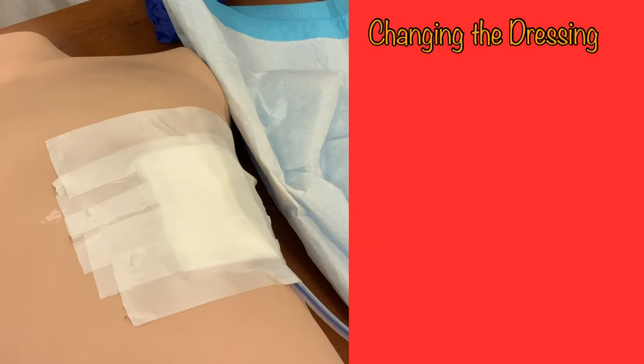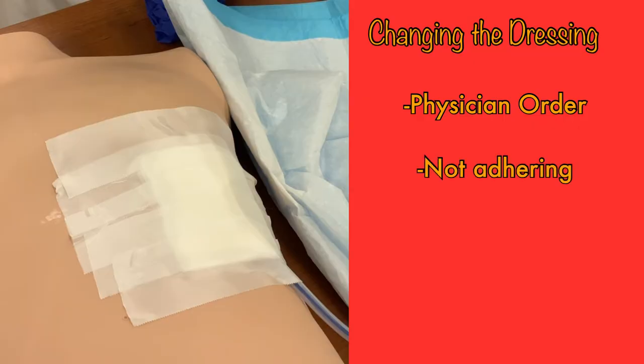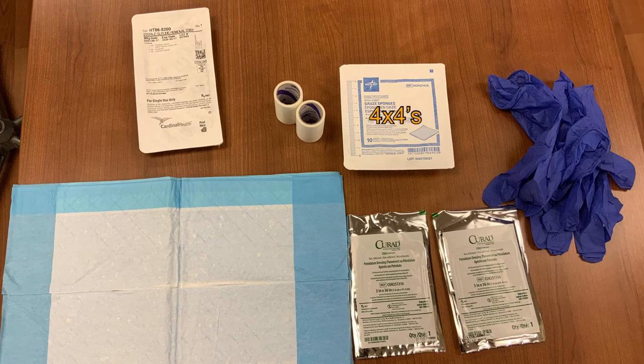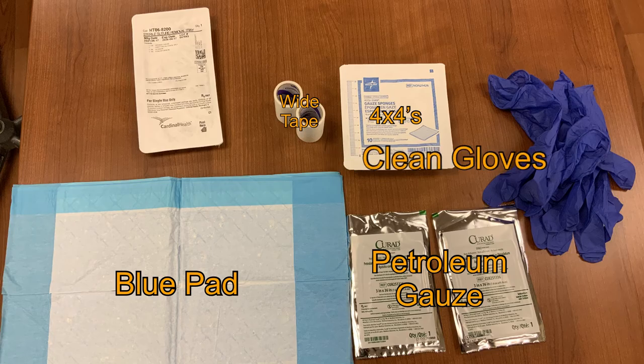There may be times when the nurse needs to change the dressing around the chest tube. This may be ordered by the physician, or you may notice the dressing isn't adhering to the patient or has become soiled. In all of these cases, a new dressing will need to be applied. First, gather your supplies: a pack of 4x4s, the wide rolls of tape, petroleum gauze, a blue pad, and clean gloves. The suture removal kit will only be needed if the tube is being removed, which is not typically done by the floor nurse and will not be discussed in this video.